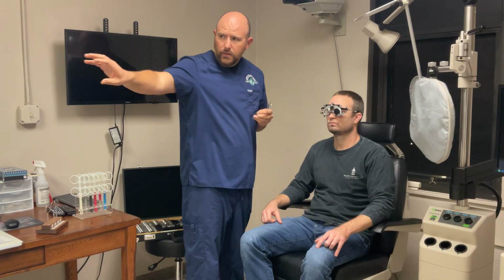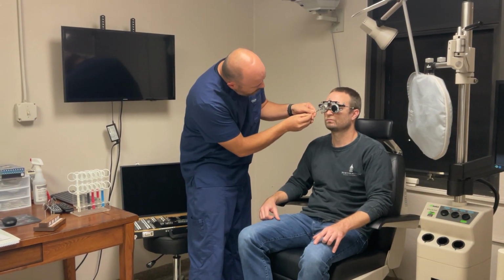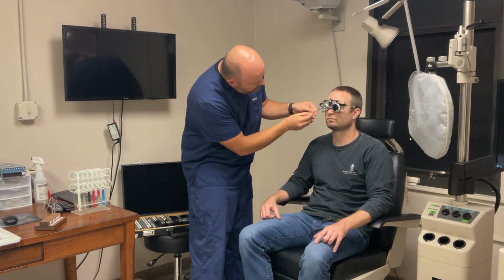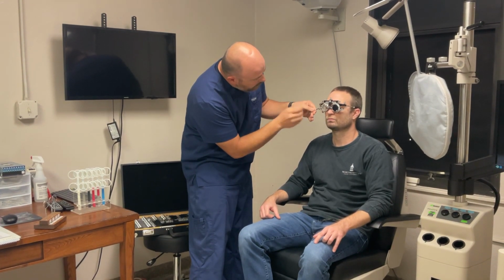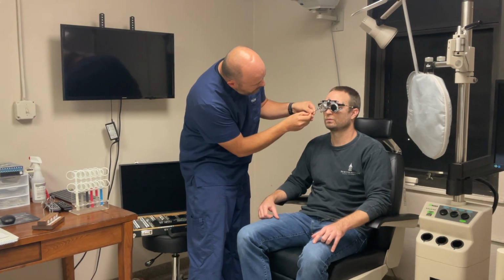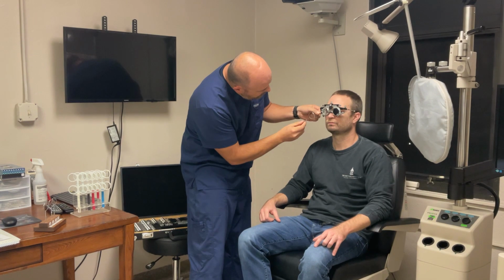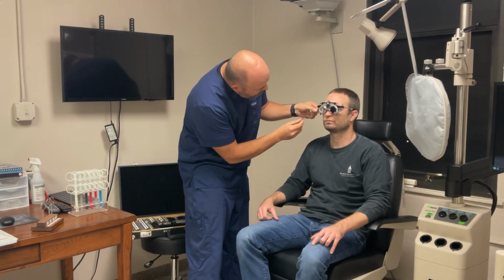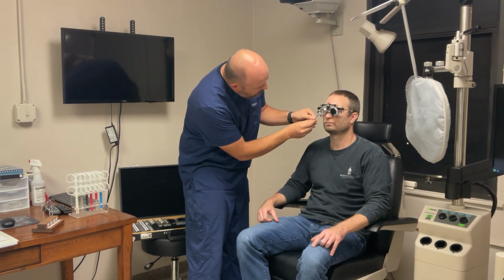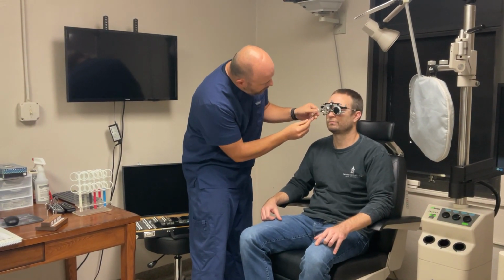All right, so still looking at that C for me, okay? I want you to tell me which one makes that C appear more real or more circular. Here's 1, and here's 2. 1. 1 was a little better, okay. Same thing, here's 1, here's 2. 1, okay.